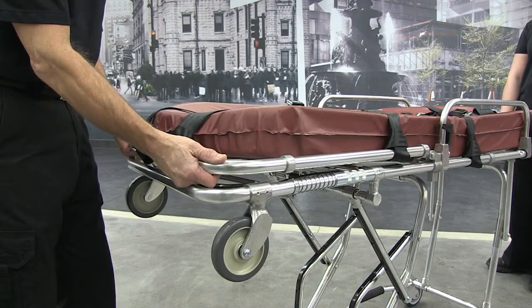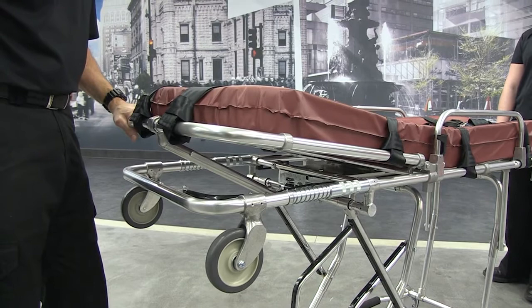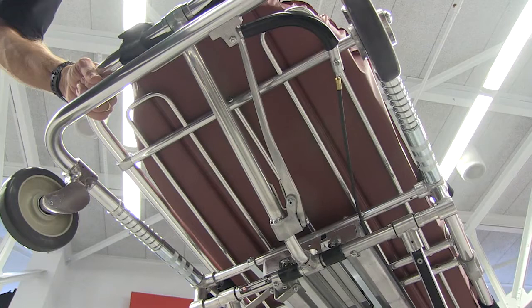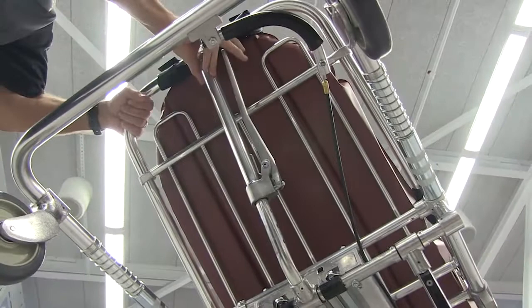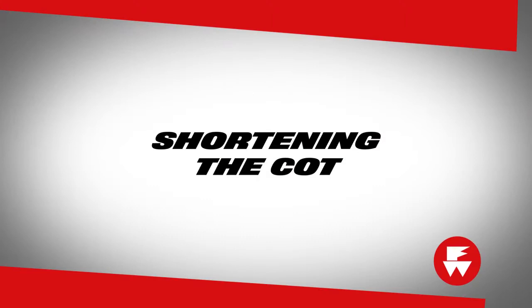To adjust the backrest from the flat position to the first position, grasp the backrest frame and lift. The backrest support engages automatically at the first raised position. To adjust the backrest from any raised position to any other position, support the backrest frame with one hand and squeeze the adjustment lever with the other. Move the backrest to its new position and release the adjustment lever. When the backrest locks into position, let go of the backrest.